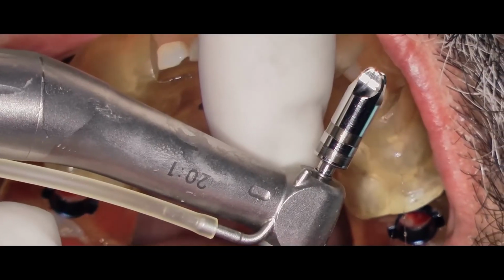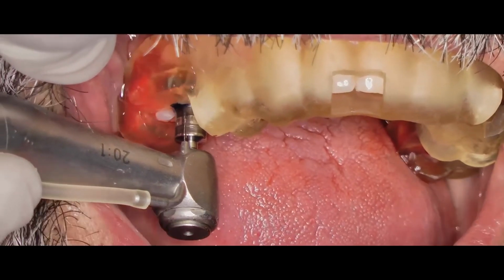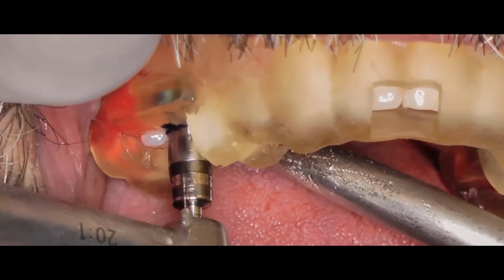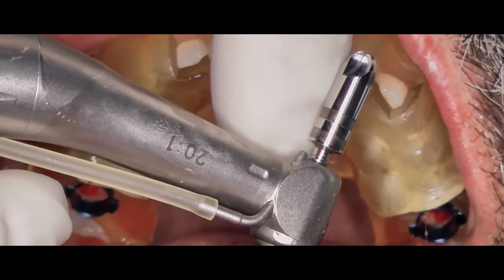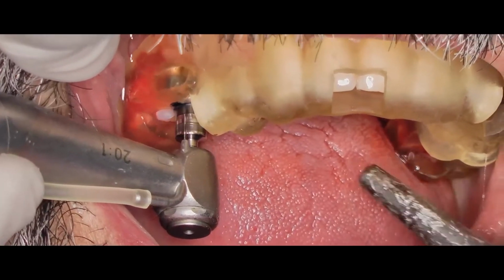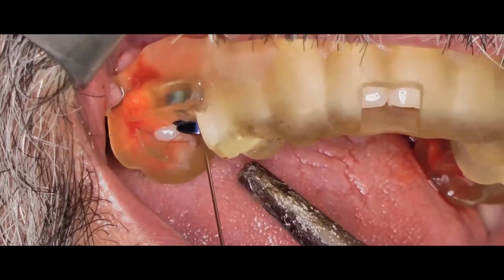The second bore is designed to flatten the ridge by removing bone, and I am using the first mark as a reference because it indicates the 9mm offset, which is the distance from the crest of the implant to the guide tube stop. I am using high rotation along with copious irrigation, making sure that we remove this burr quite a few times from the guide tube in order to remove the bone debris that may be present.